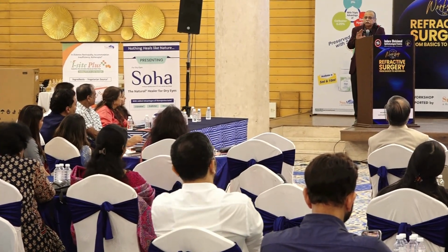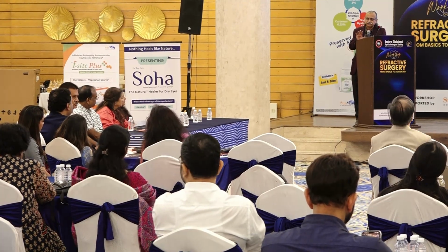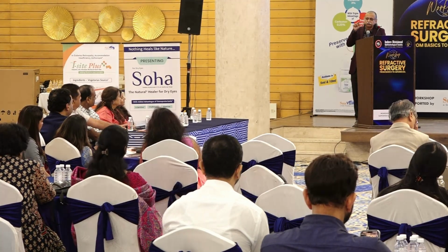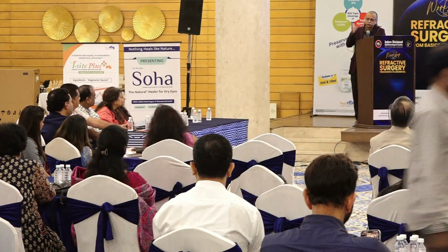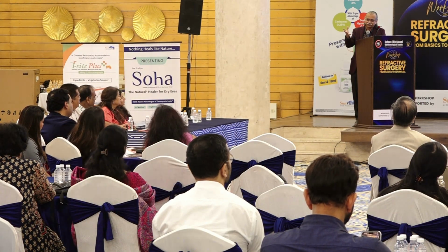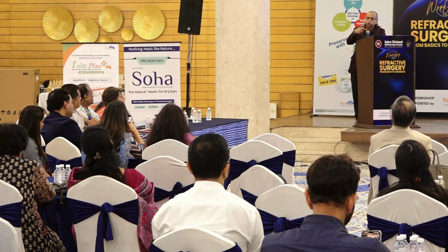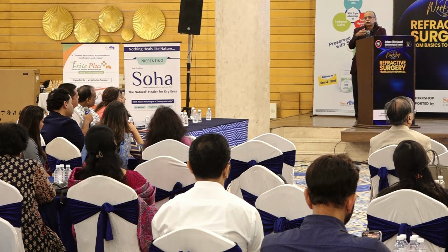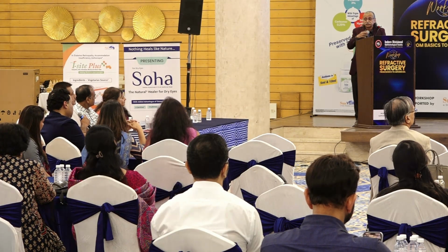For example, if the scotopic pupil is 4.5 or less, it does not allow. Now we have circumvented it: we do axial length and topography with an undilated pupil, and we do aberrometry with a dilated pupil. Because for registration it is using the topography image, so small pupil. Like that we are doing, and therefore the indications are increasing.